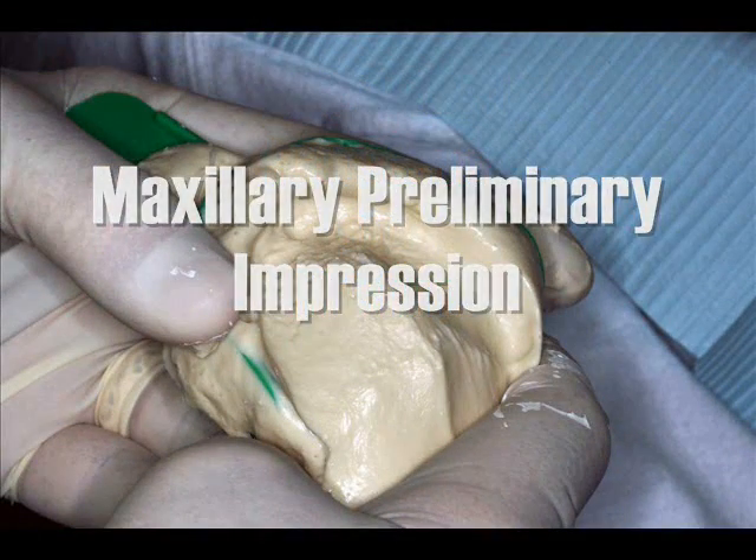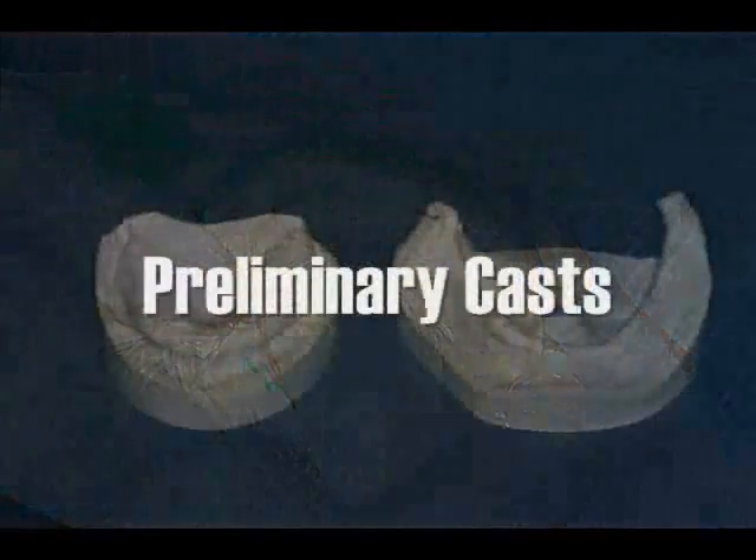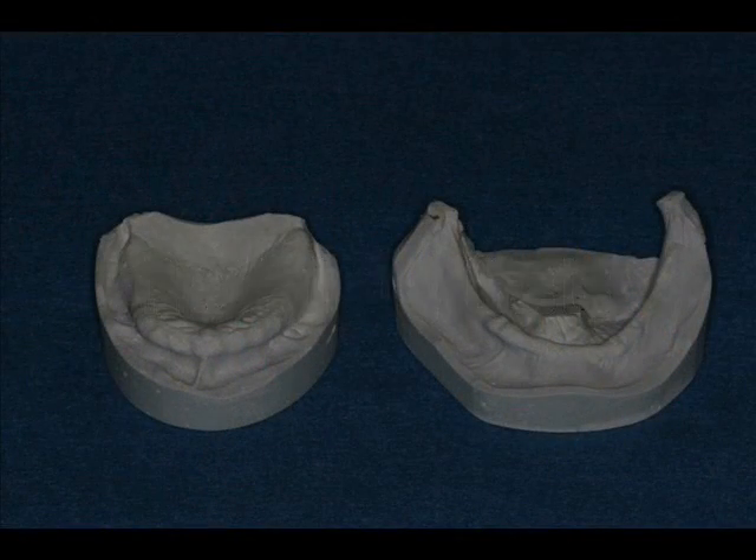A disposable plastic stock impression tray is used to make a preliminary impression. Preliminary casts aid in diagnosis and in the fabrication of custom impression trays.